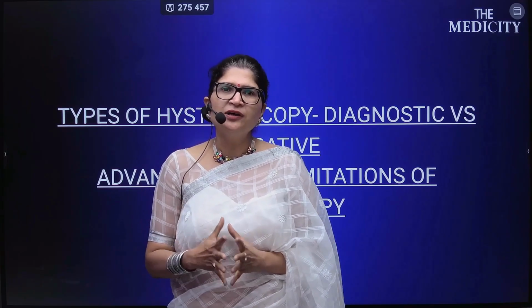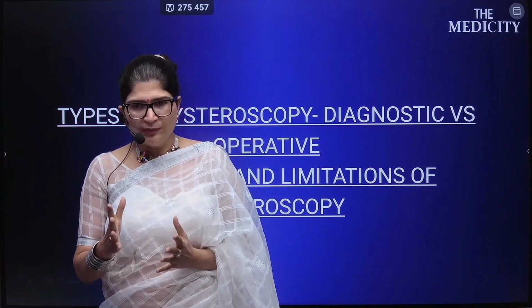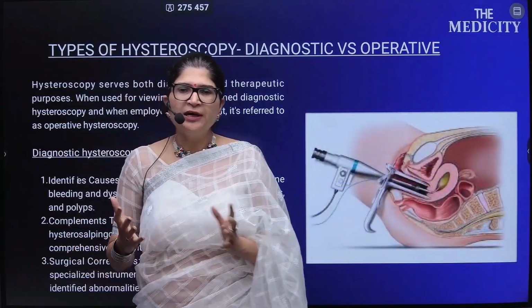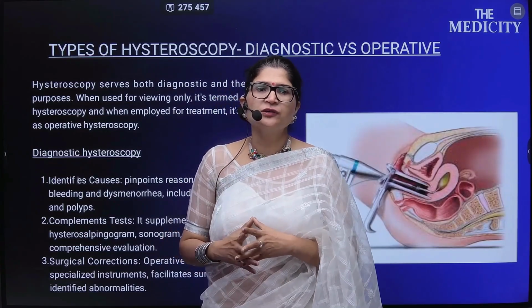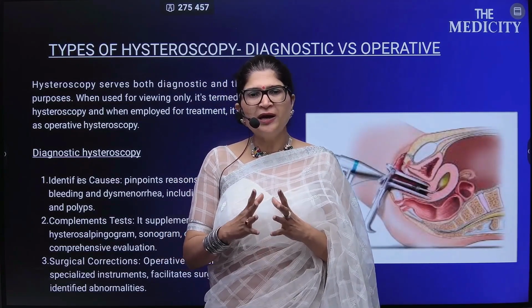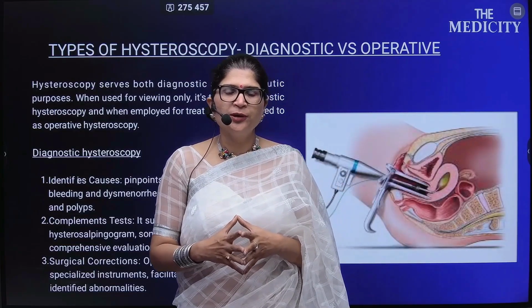Moving on to the types of hysteroscopy, we say diagnostic versus operative. There might be some advantages and limitations of hysteroscopy in both the types. We will be discussing those. Types of hysteroscopy may be diagnostic or operative. So when we compare diagnostic versus operative, hysteroscopy serves both diagnostic and therapeutic purposes.